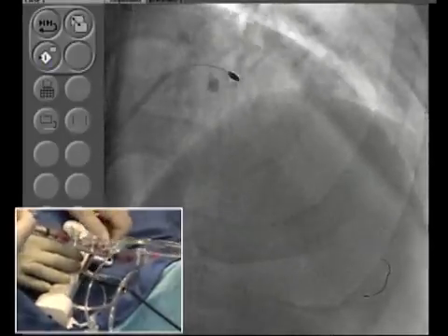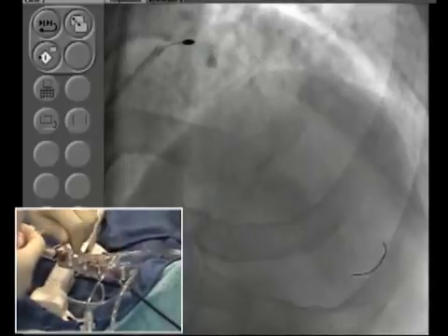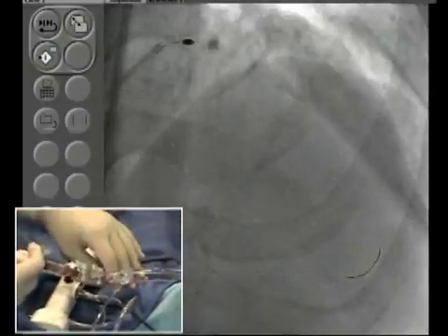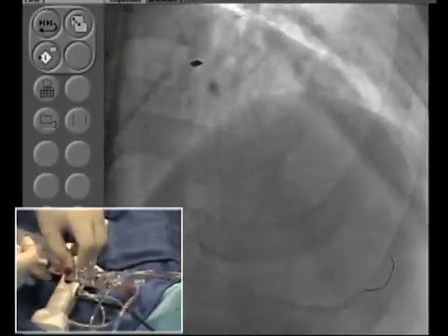And this is the most important part of rotational atherectomy: when you are at the distal end of the lesion, you have to be really careful. That's your exit. If you are trying to push, thinking that's it, a couple of millimeters left, let me just get the burr through, that's when it can perforate or also cause a spiral dissection.